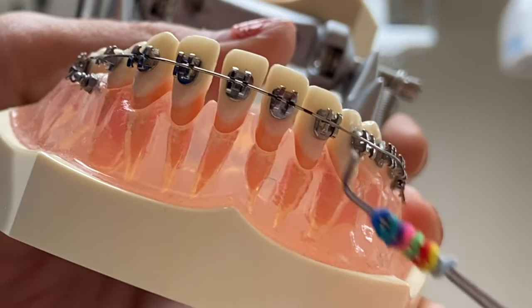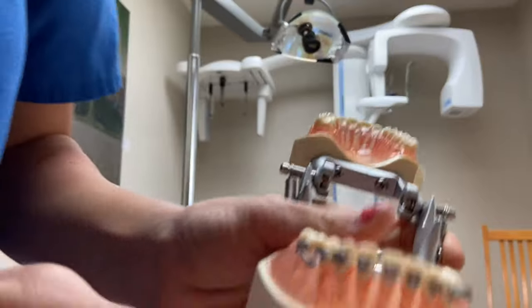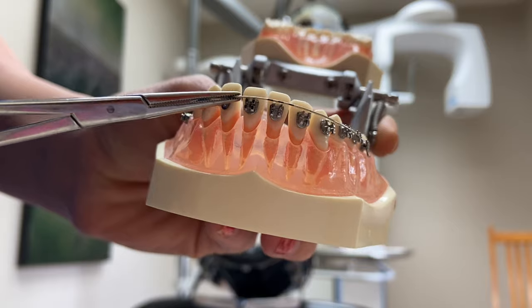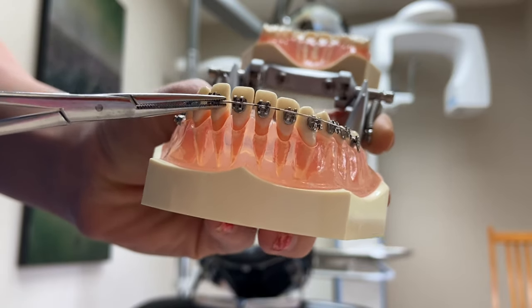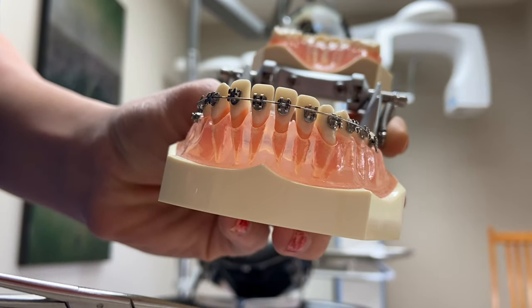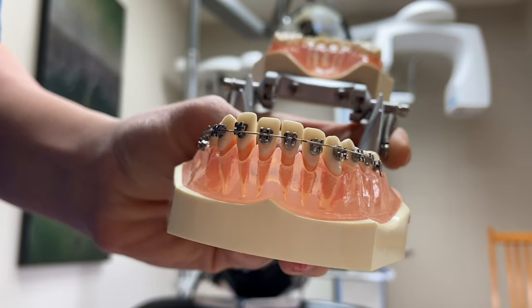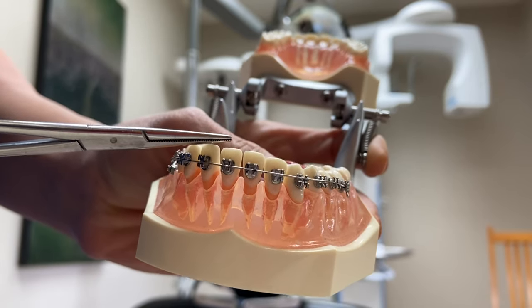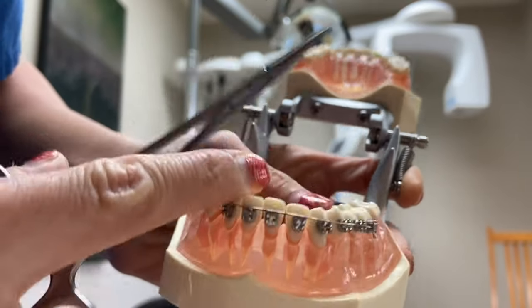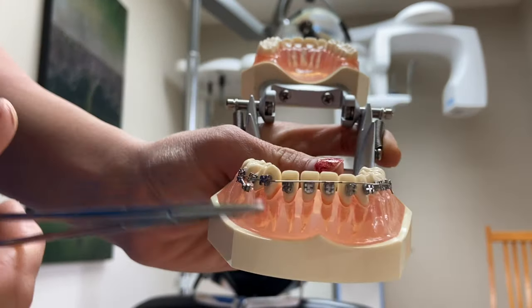So now we just have the brackets and the wire. The wire sits in the brackets — see, it moves. And then we put the wire into the brackets. That's where the colored ties come into play — they just tie around the wires so the wire stays in place. So now I'm going to show you guys how we put the ties on.